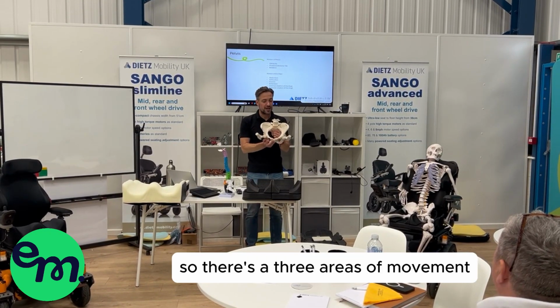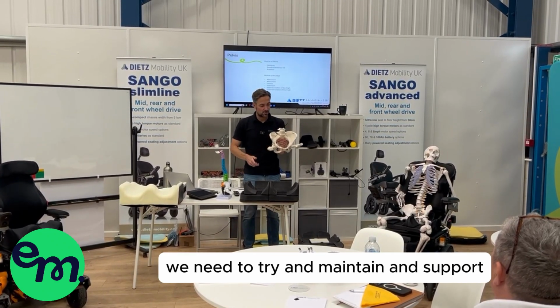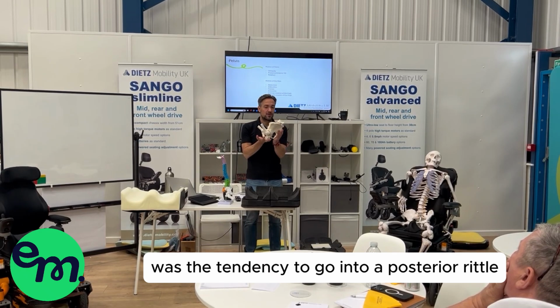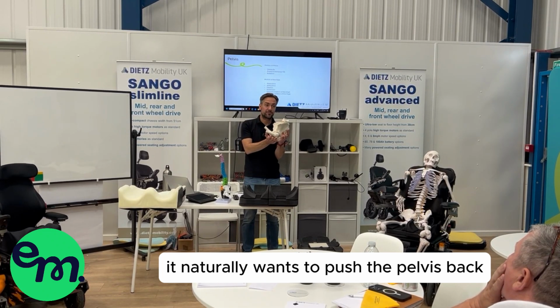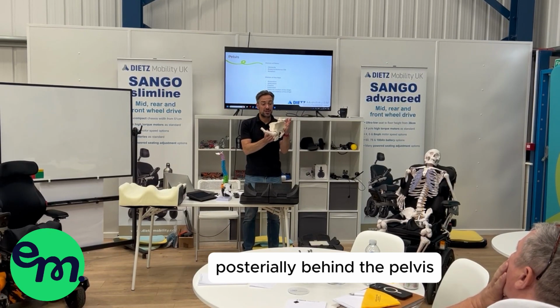So there are three areas of movement that we're going to find in the pelvis that we need to try and maintain and support. The most common one, like we talked about this morning, was the tendency to go into a posterior tilt. A little reason behind that is that as we close the hip angle up, it naturally wants to push the pelvis back. So in order to stop that from happening, we need to have a little bit of support posteriorly behind the pelvis.